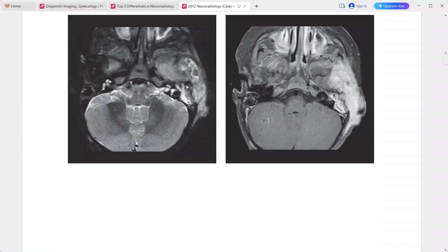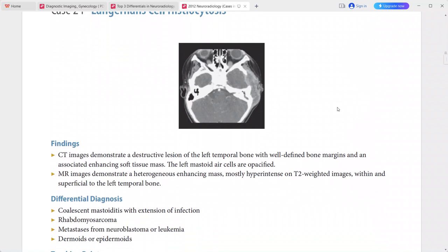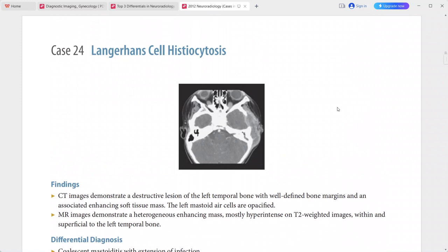This is a case of Langerhans cell histiocytosis. Differentials include coalescent mastoiditis with extension of infection, rhabdomyosarcoma, metastases from neuroblastoma or leukemia, and dermoid or epidermoid.